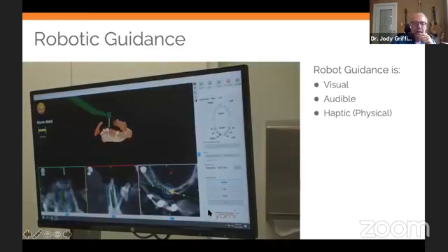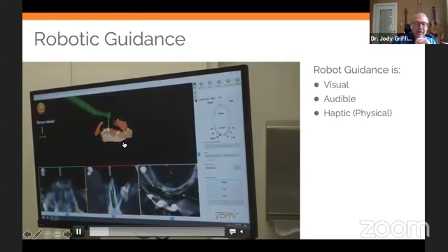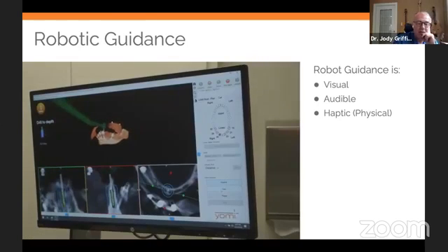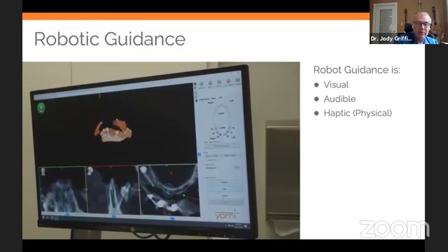And so you can see here, a lot of times you'll get skiving on those knife edge ridges, but you can see it just keeps the burr right in position, and that's a pretty narrow ridge, and it just goes right to the place. So you hear it audibly, plus you visualize it and get to see it.